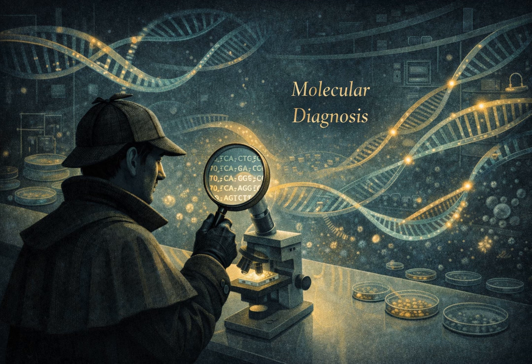So you can see it. The tag might be a radioactive isotope, though we use those a lot less now for obvious safety reasons. More commonly, it's an enzyme that can trigger a color change or a chemiluminescent or fluorescent molecule. So the hook sticks, you wash away all the unattached probes, and if there's any signal left, you see the light. That's it. You found your target.